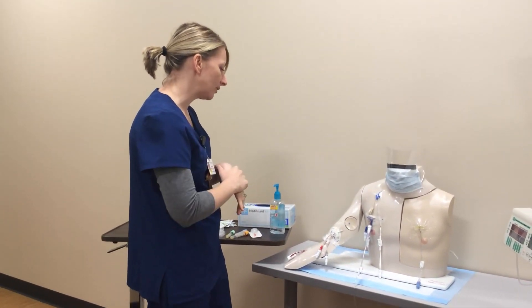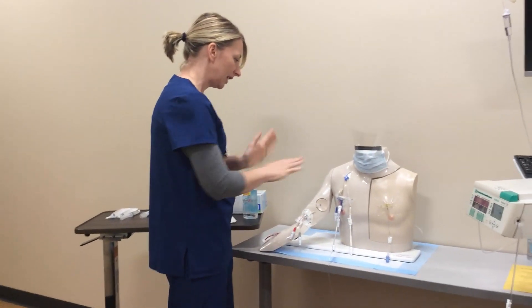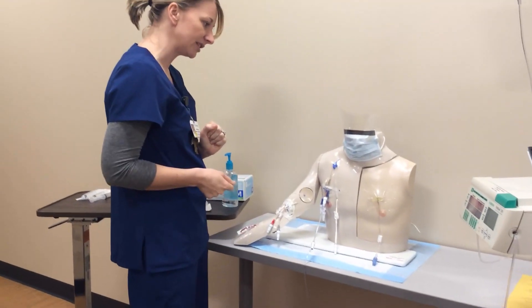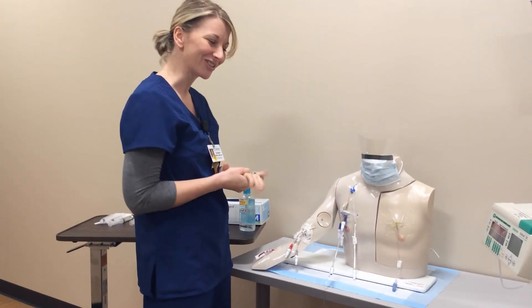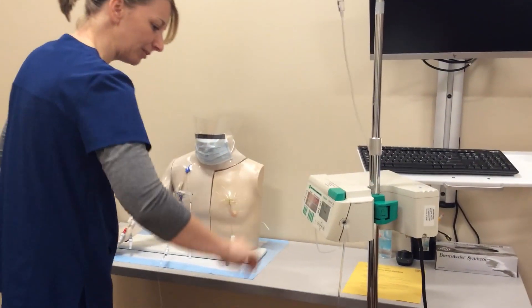You don't have to do any work basically. What I'm going to do is disconnect you from your IV fluids through a series of syringes being attached to your central line. I'll draw blood for waste, draw off the blood to send to lab, then flush a little bit and hook you back up to your IV line. He says sounds good. First thing I want to do is put my IV pump on hold.